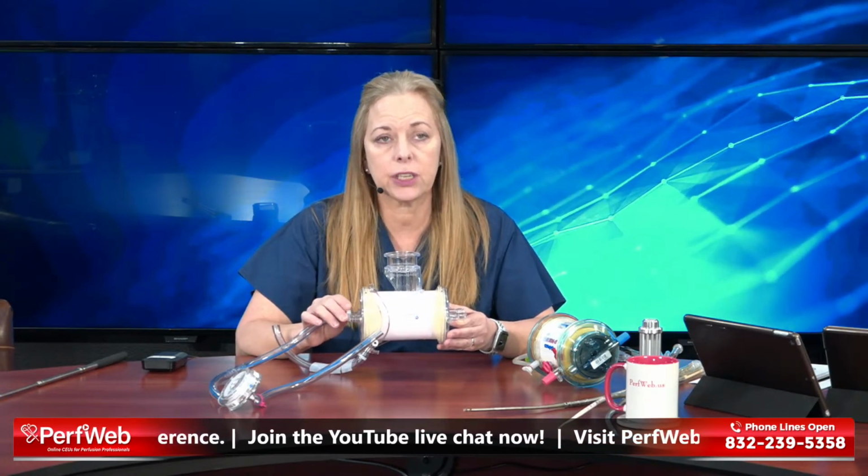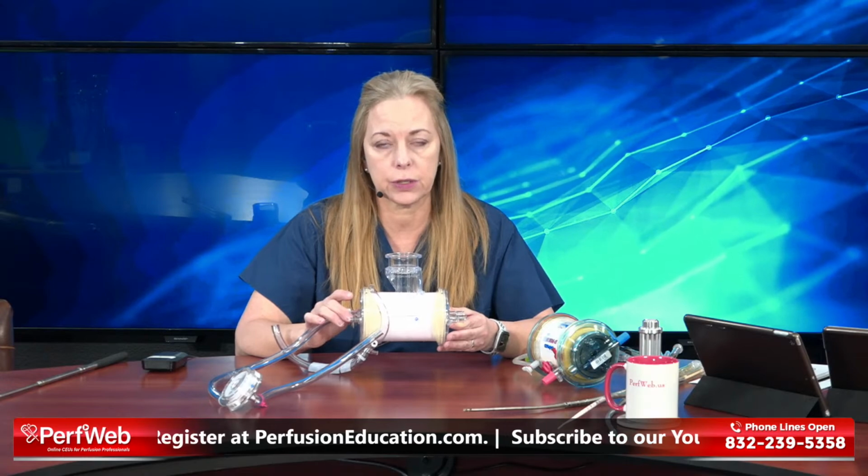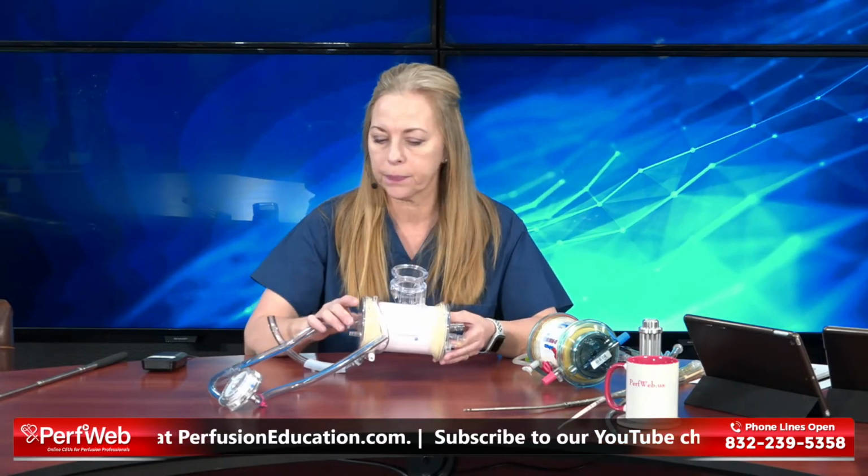We had several patients that were on propofol initially, and then they got transitioned off, sometimes 6, sometimes 12 hours later, or maybe they were put on a little propofol just for a little procedure and then it was taken off, and the oxygenator worked fine. We just kept a close eye on it.